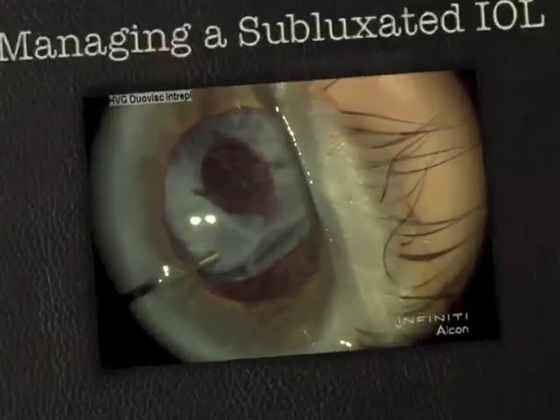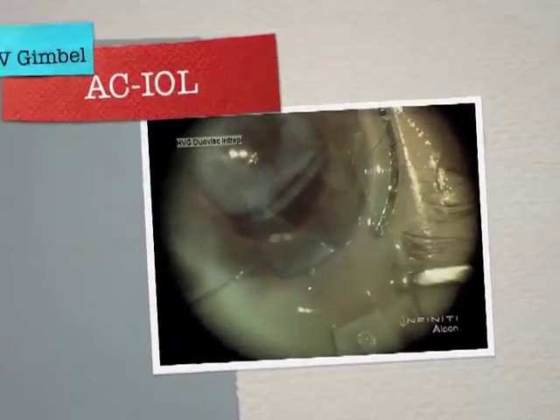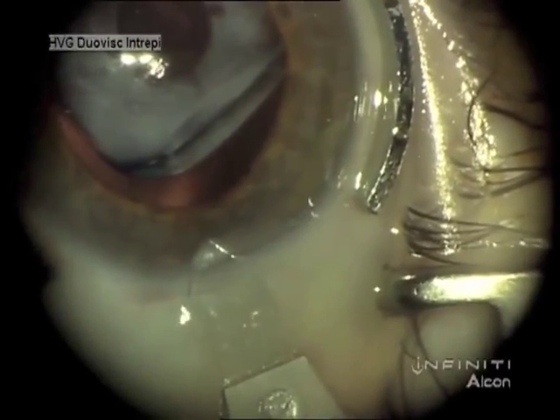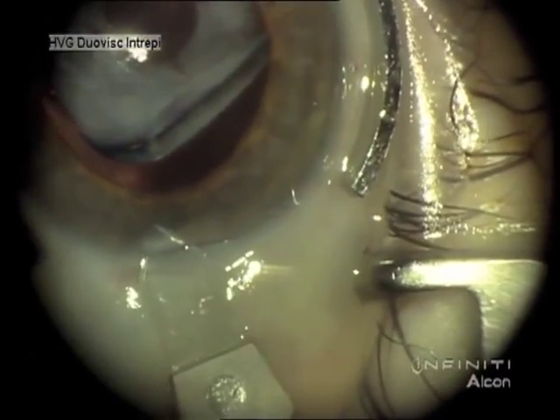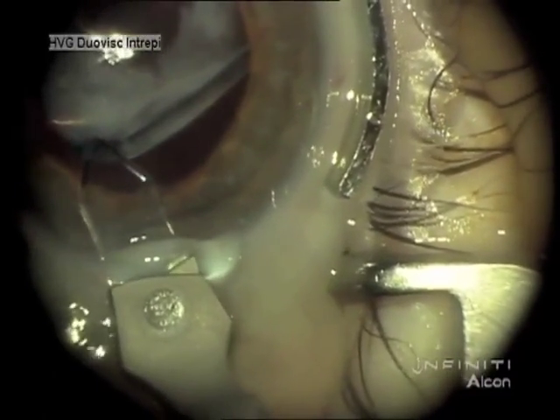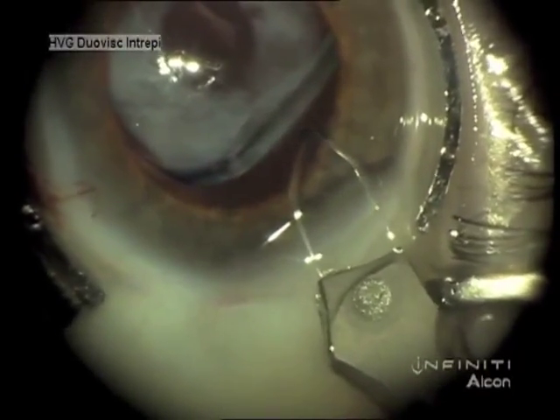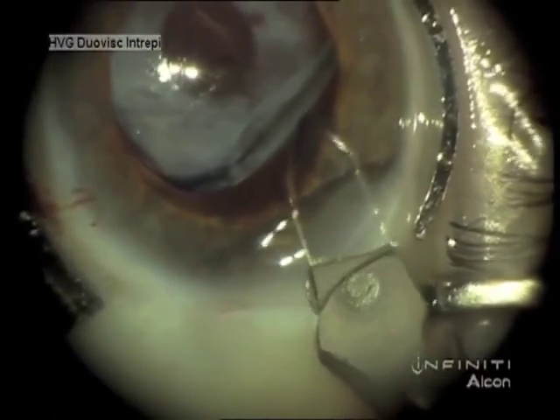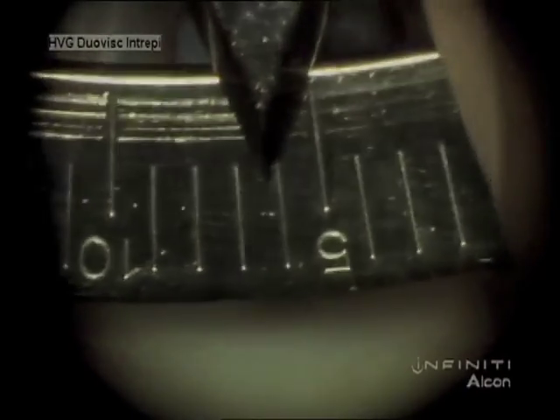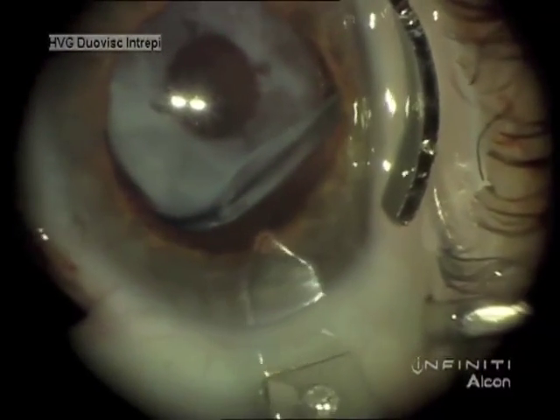This is Dr. Kimmel. It's a subluxated IOL bag complex removal where the capsule has shrunk with phimosis, and you can see the haptics curled right against the optic. So it wouldn't be appropriate to try to reposition this for the best quality vision. I elected to remove it and replace it with an anterior chamber intraocular lens.